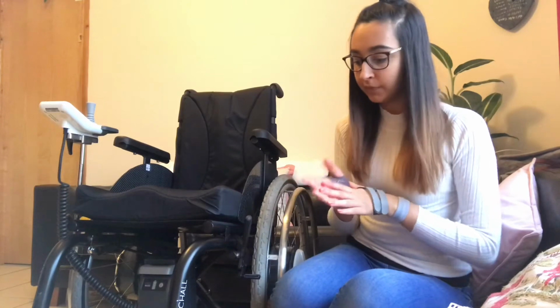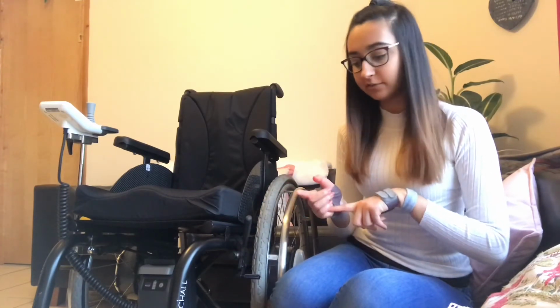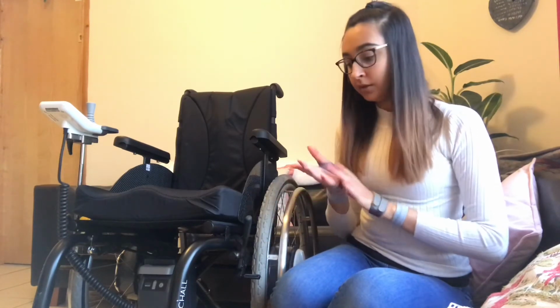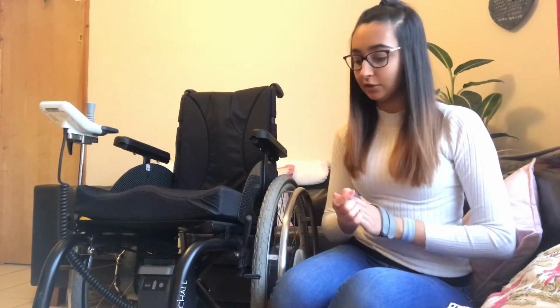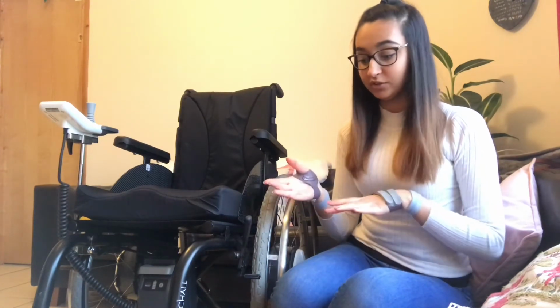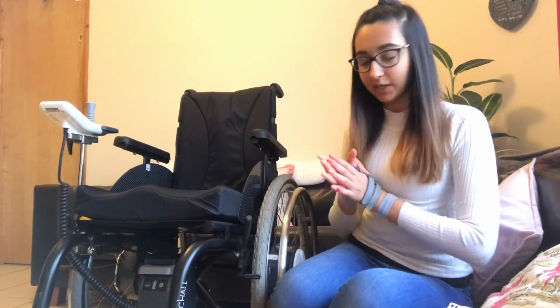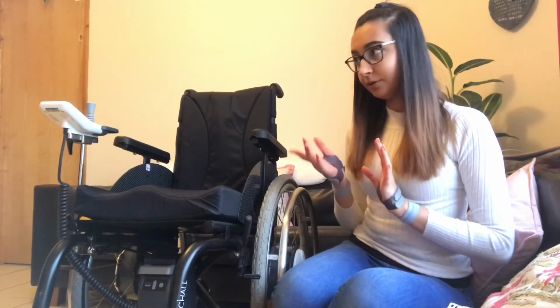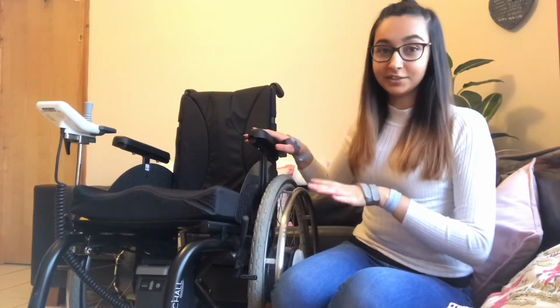These ones are carbon, so usually they'd be a bit more expensive, but there was a problem with my chair, and so I got them for free. But there are plastic ones that are cheaper. Again, I don't know what they look like because I was just upgraded to those. And then in terms of the more basic specification stuff, I got matte black, and I think it was a 3-degree camber, or whatever my other camber was. So yeah, that's the chair itself.